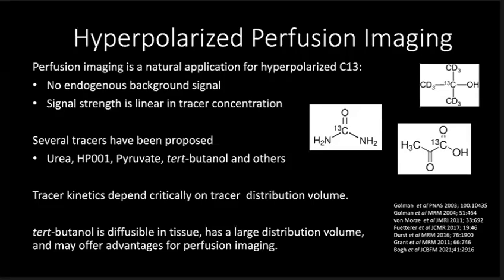This is a natural application for hyperpolarization because you don't have any endogenous background signal. You don't see anything until you inject the tracer. That's both good and bad. It makes your pre-scan pretty hard because you don't have any C13 until it's there. Yifan laughs because she knows how this can give you PTSD over time.